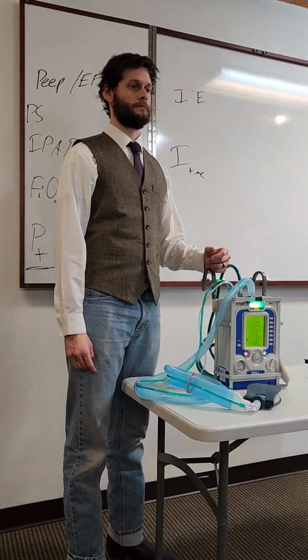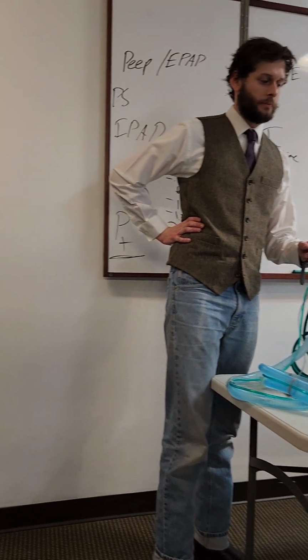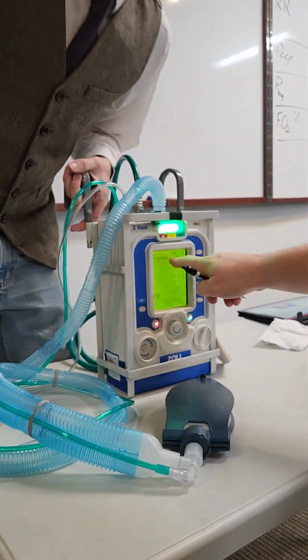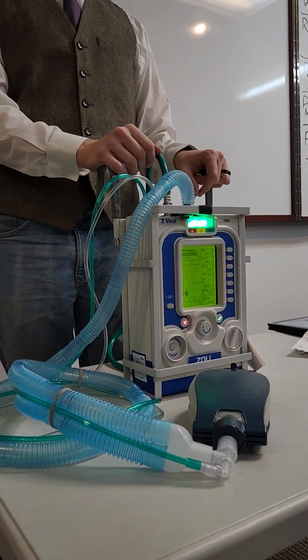Okay. So if you wanted to change this back, so I want to change it back to IE. Yeah. So you hold that. Okay, so it comes out, it tells me that it's in I time. Yep. Then you select. That's what I wanted to see right there. Yep.